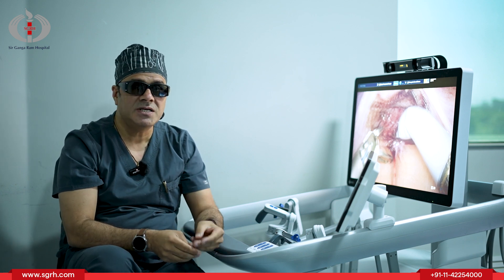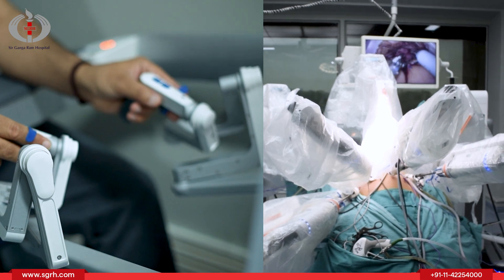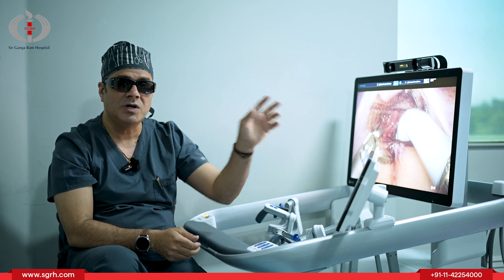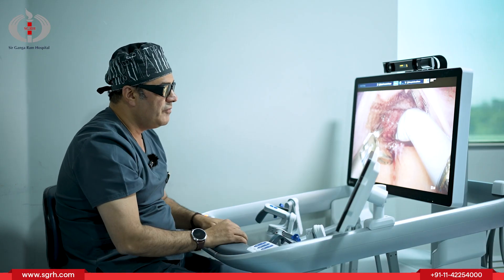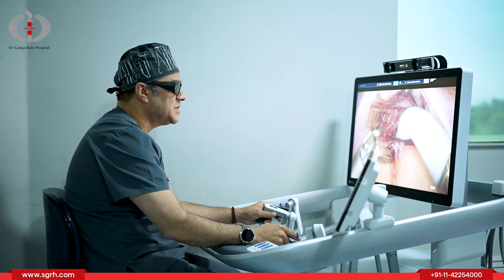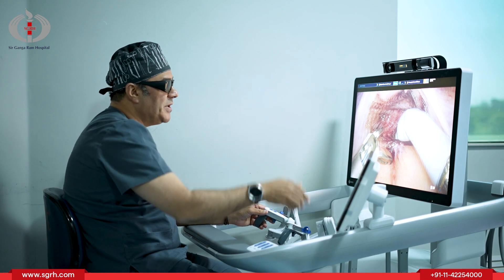We have three parts. One is the console on which the surgeon sits and makes the movements for the surgery, which are being replicated on the patient side. The instrument goes to the side arm which are docked to the patient. This is the console which has a 3D screen, and to watch it we have to wear the 3D glasses. These are the grips on which we make the movements, and these movements are being followed by the robotic arms on the patient's side.